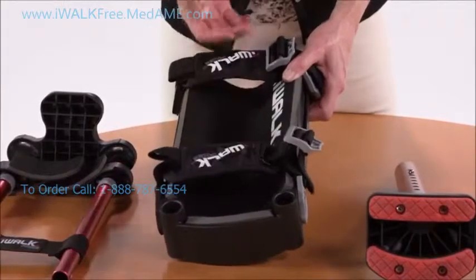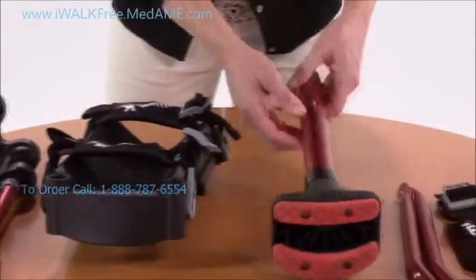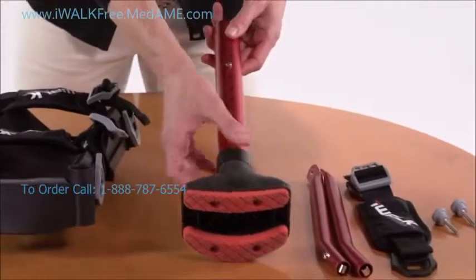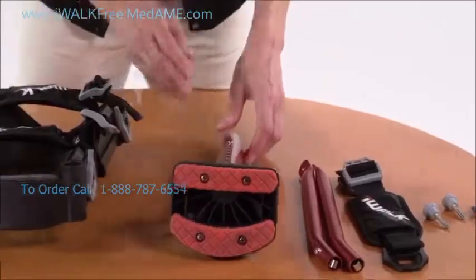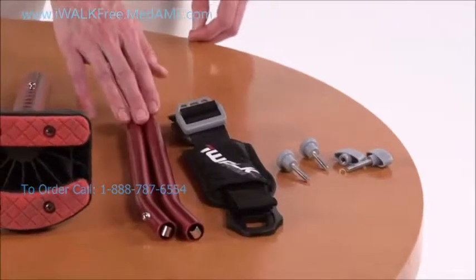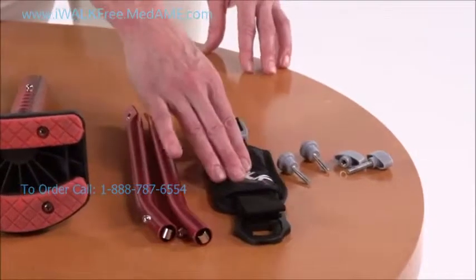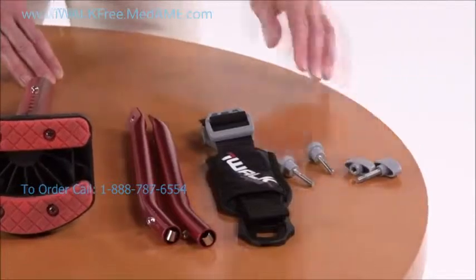Then there's the lower assembly, where you'll find the height adjustment tubes, a clamp, and the foot. There are only a few more parts to the iWalk: these two support tubes, and inside the bag you'll find a third strap, a couple of thumb screws, and a clamp nut and bolt.